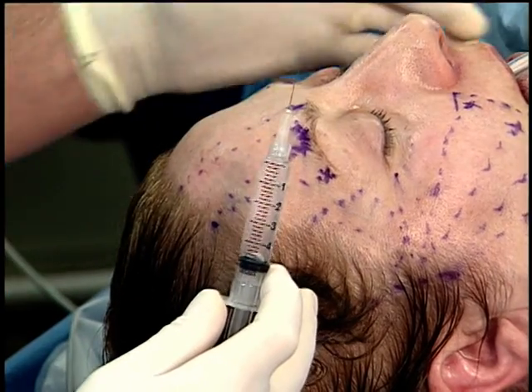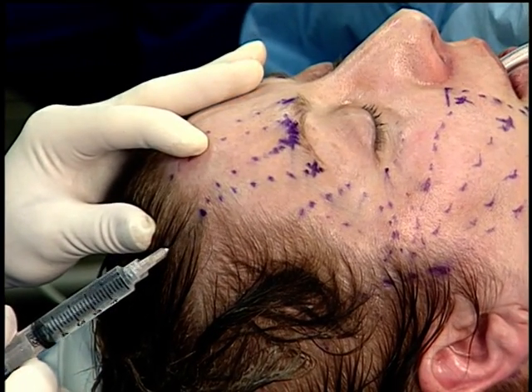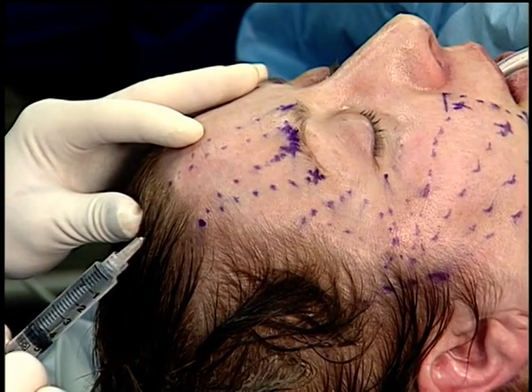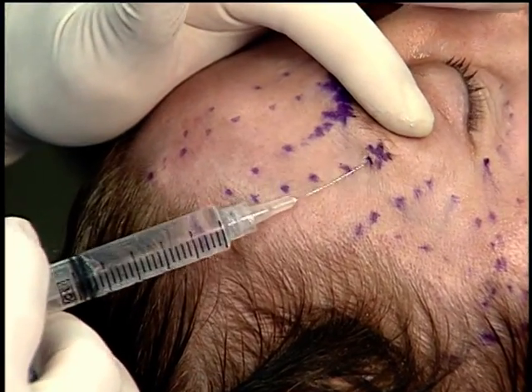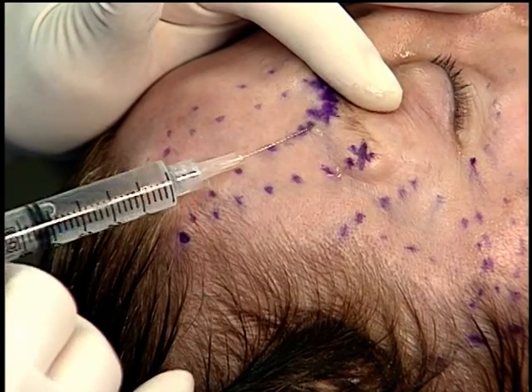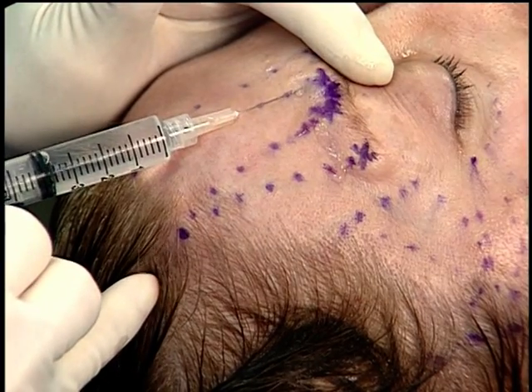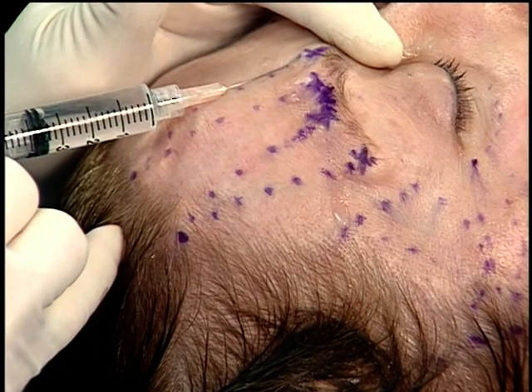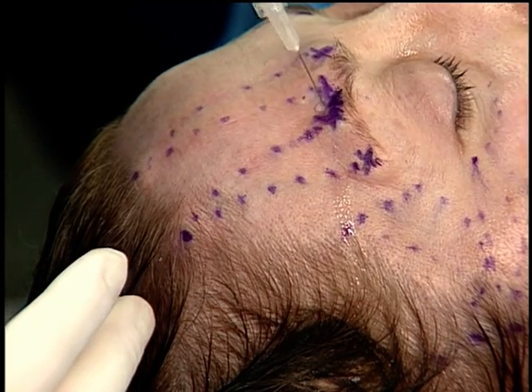So once you've got your 0.5% solution, we begin by anesthetizing. I do intradermal anesthesia, raise an intradermal wheel wherever I have a deployment anchor port, because you're going to be doing a little slit or a hole punch there, and obviously intradermal anesthesia wherever you're exiting. The reason for intradermal is that's where the pain fibers are. You're going from the subcutaneous space right through the skin, and you want to make sure you get those type C pain fibers and Meissner's corpuscles to ensure anesthesia. If you're doing this under local, you don't want the patient nicely relaxed, only to jump up and down every time you exit because you haven't adequately anesthetized the dermis.